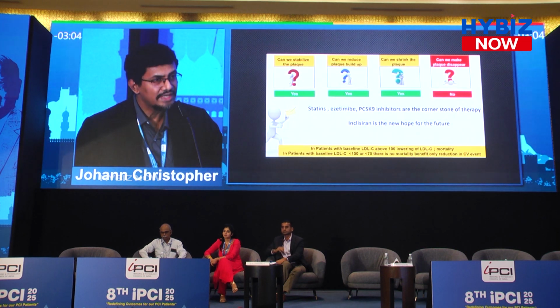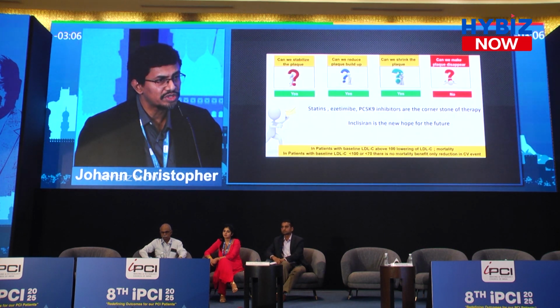So, ladies and gentlemen, CT is a very good screening technique. It's completely non-invasive. The radiation levels are very low, almost less than 1 millisievert. It's a great screening tool and possibly the only non-invasive tool which can look at plaque currently.